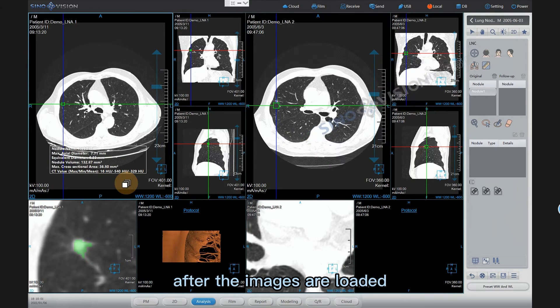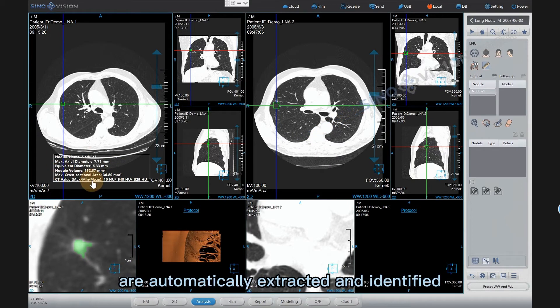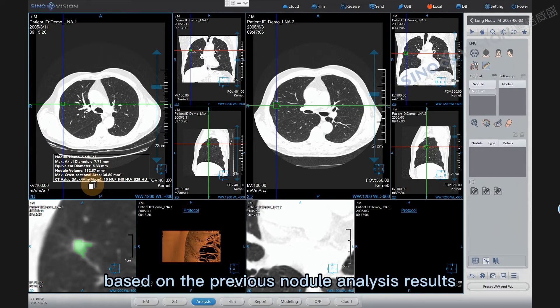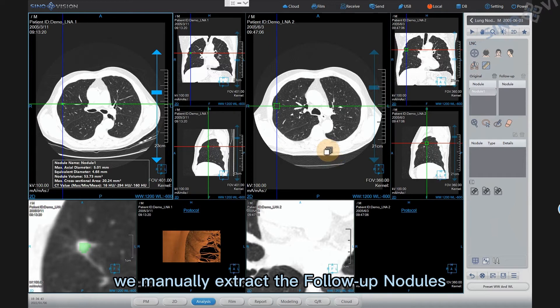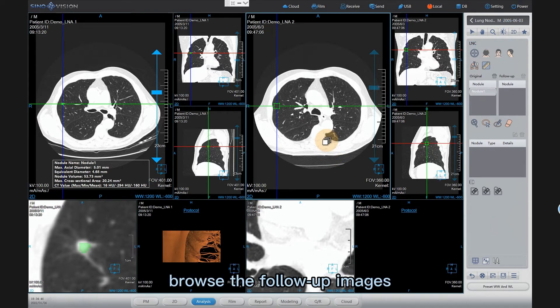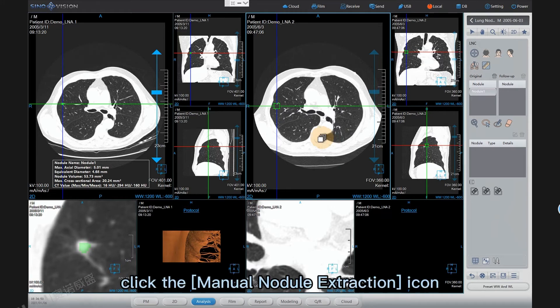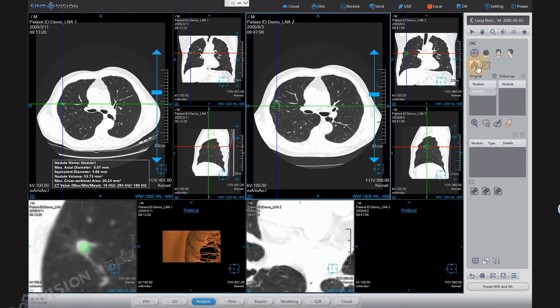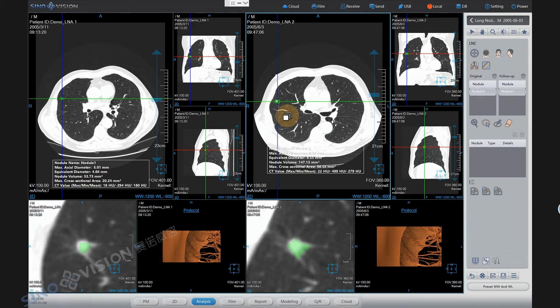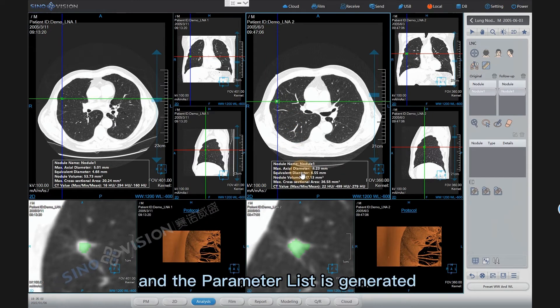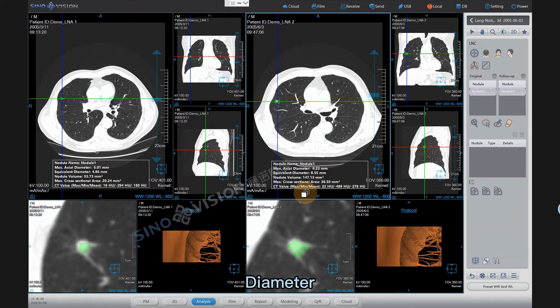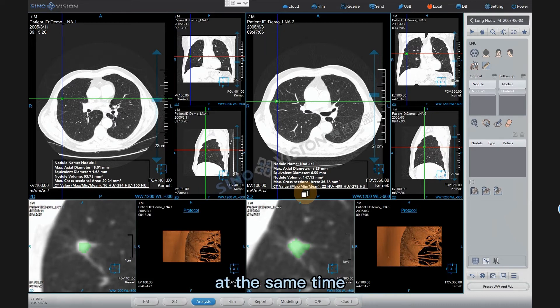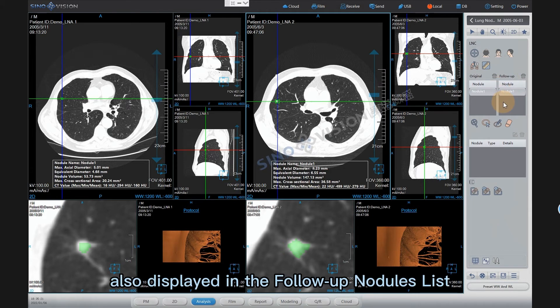After the images are loaded, the previous nodules in the original series are automatically extracted and identified based on the previous nodule analysis results. After the original nodules have been extracted, we manually extract the follow-up nodules. Browse the follow-up images and find the level of the nodule. Click the manual nodule extraction icon and click on the center of the nodule to extract it. The nodule is now extracted and the parameter list is generated on the follow-up axial image too, including nodule name, diameter, volume, CT value, etc. The nodule is also displayed in the follow-up nodule list.